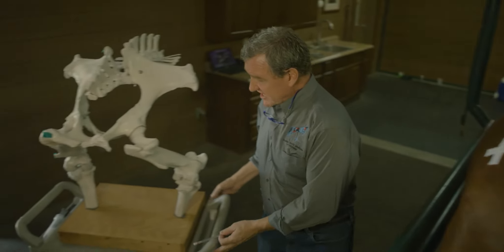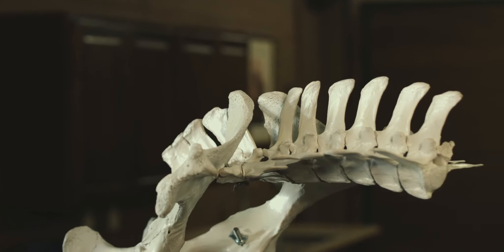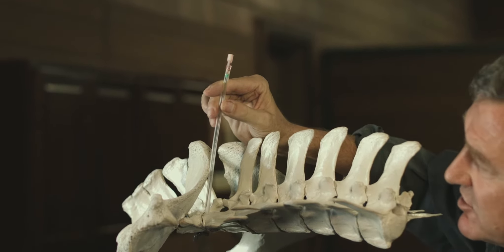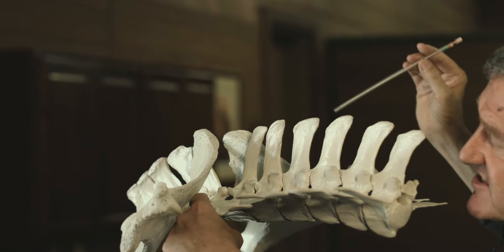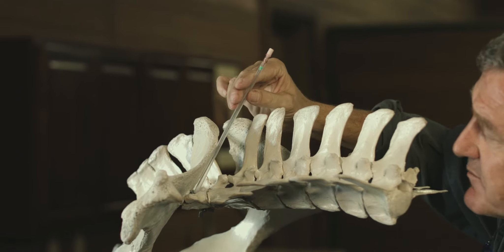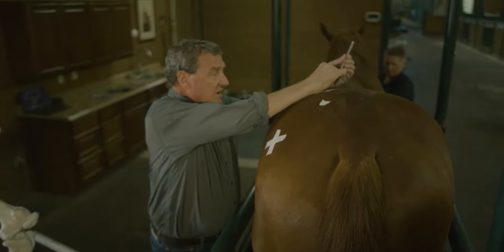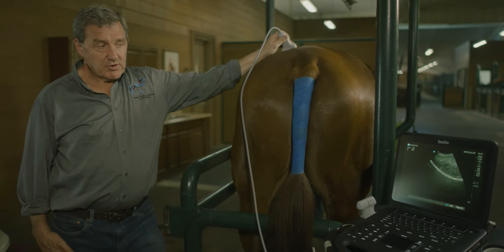Going back to the injection point for the intertransverse joint, I'm going to reverse our pelvis. You can see that underneath the wing of the ilium your needle is going to pass at that same angle I showed on our patient to get right down to this joint. You don't want to go parallel to the ilium — that dorsal portion of the sacral wing is where they have the dorsal interosseous sacroiliac ligament, which is very dense. You don't want to just do a ligamentous injection; you want to pass down about 10–15 degrees to the intertransverse joint. On our patient, that's going to be roughly this distance from the midline and at this angle to get to that joint.